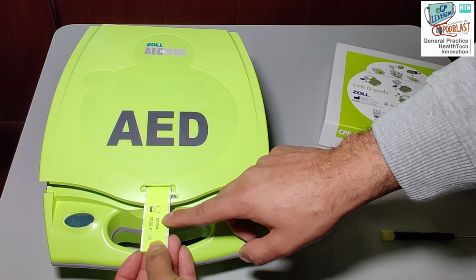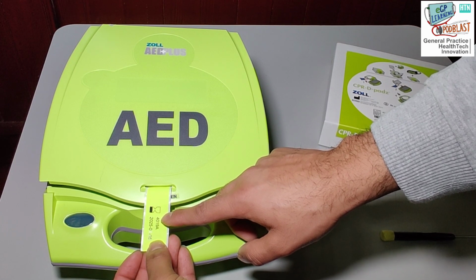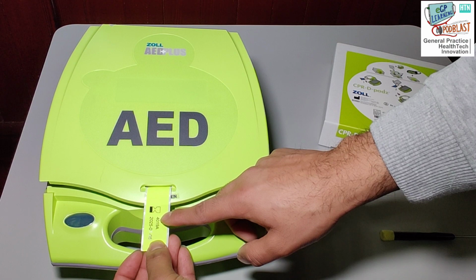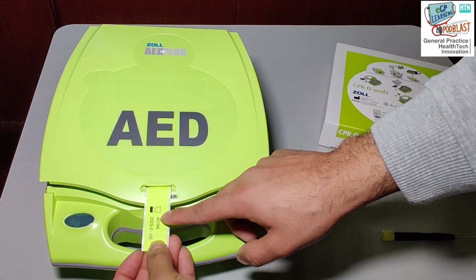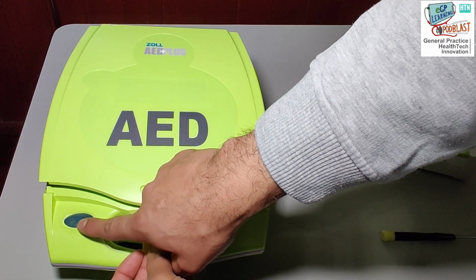These do have a shelf life of 5 years, similarly so does the battery pack, at which time it is sensible to change both at the same time, and therefore making sure that you've got a safe and active device at all times. In order to check whether the device is functioning, this green tick should always be visible.